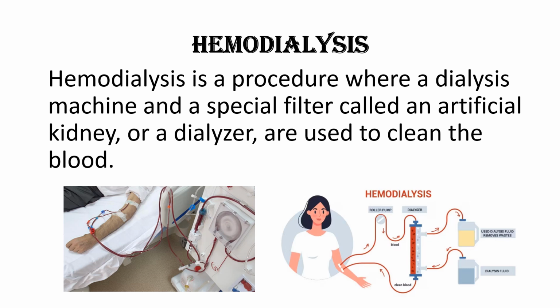Hemodialysis is a medical procedure that uses a dialysis machine and a special filter. This removes waste products such as excess fluid and electrolytes from the blood. This process helps to remove the urea and other waste products that build up in the blood due to kidney failure. Apart from this, it also restores the balance of electrolytes such as potassium, sodium, and calcium, and also removes excess fluid and controls blood pressure.